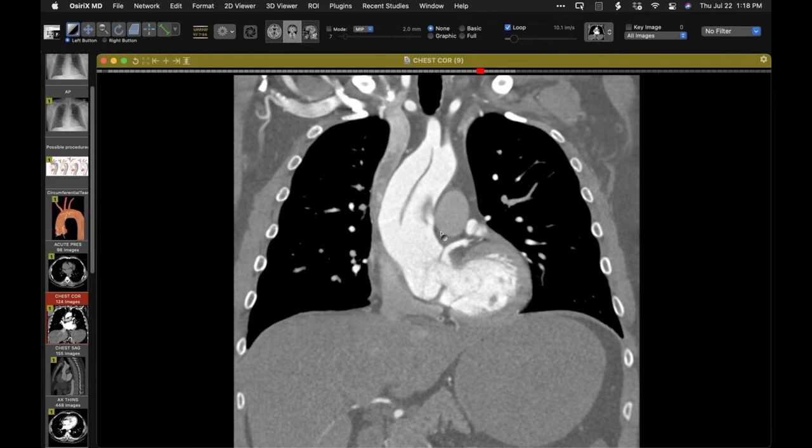So sometimes the flap extends into these brachiocephalic arteries. It's not really intussusception, it's just extension of dissection into those branch vessels. Right, but yeah, the case that Seth had, there was no flap visible in the aorta because it had completely, you know, torn 360 and intussuscepted.